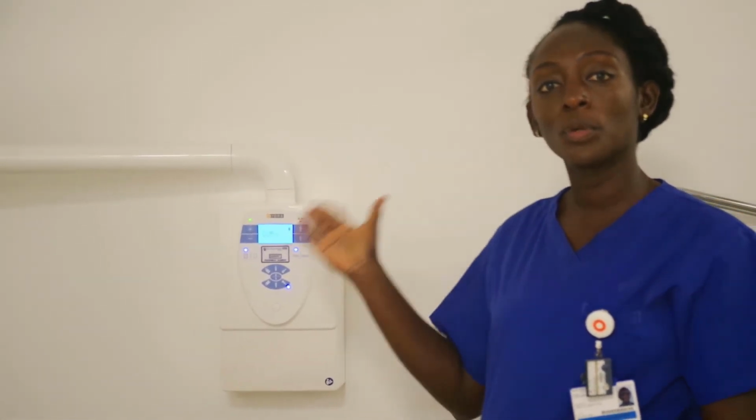Okay, so behind me is the control panel. On the control panel you've got your kilovoltage, your milliampere, which is your current, and your time. This particular dental equipment is set at an mA of 7, and the reason it's set at 7 is to prevent overheating of the filament to aid X-ray production. Also, the kV is set at 60 to 70.